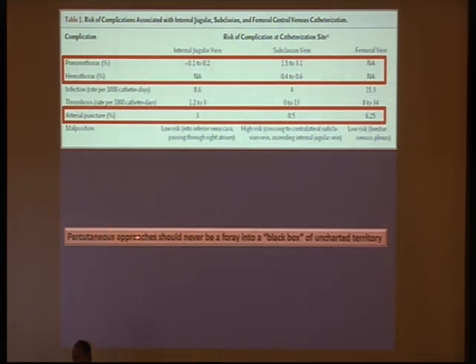Therefore, we should know at least the minimum requirements of anatomy, and we should not insert the central line as if we are going into a journey for unknown land.